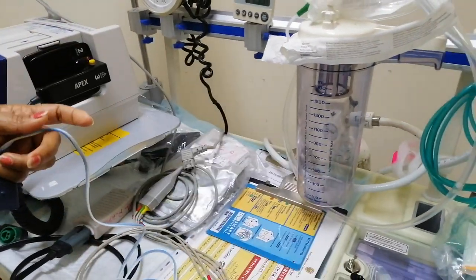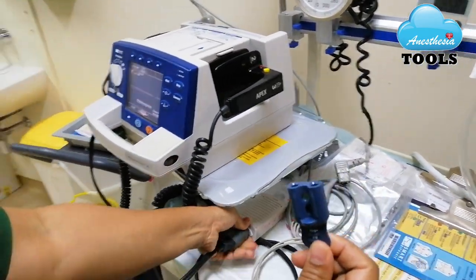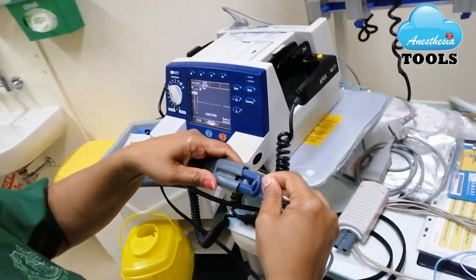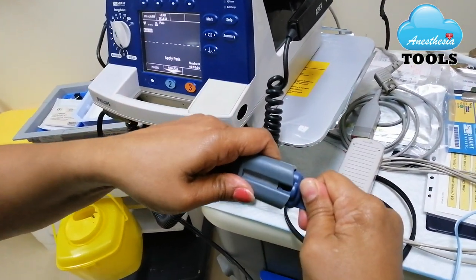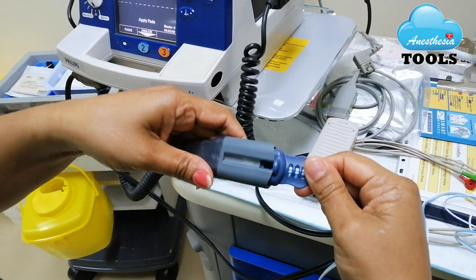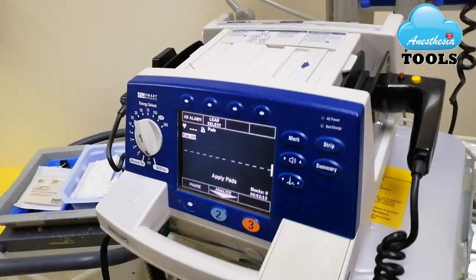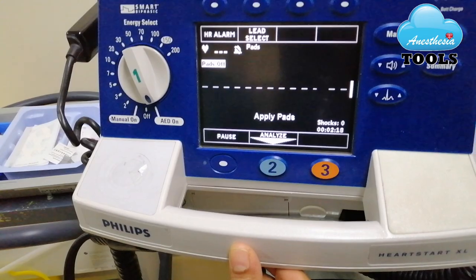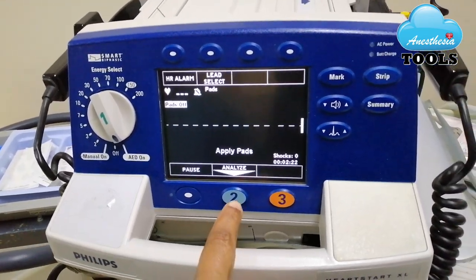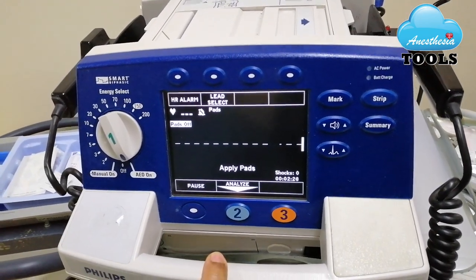There is another end of the pad that she will be connecting to the defib machine. You will hear a small click sound — that means it is nicely fixed. As soon as it is connected to the patient, it will start showing you the ECG here. Then we will follow the voice prompts from the defib. It will show us if the patient needs a shock or we just have to monitor the patient.